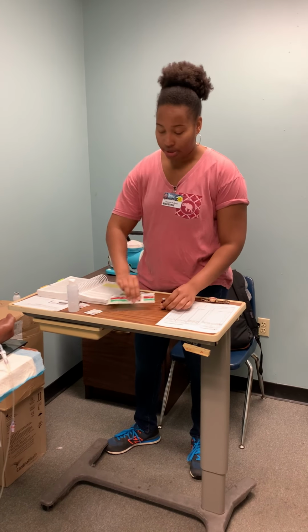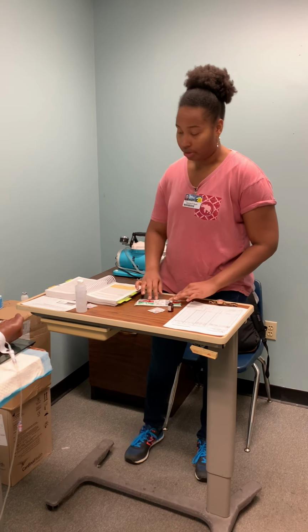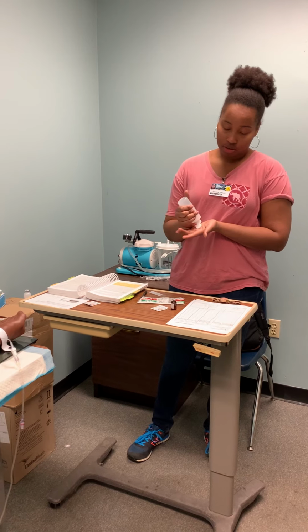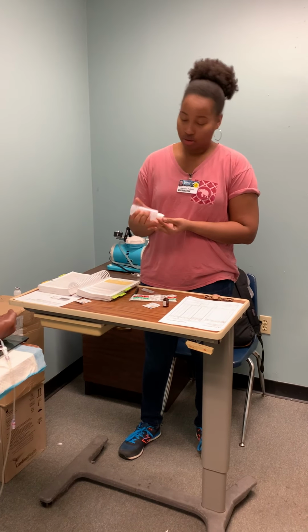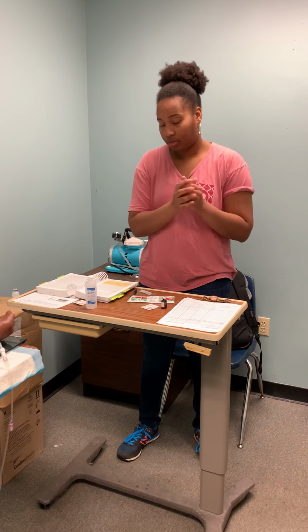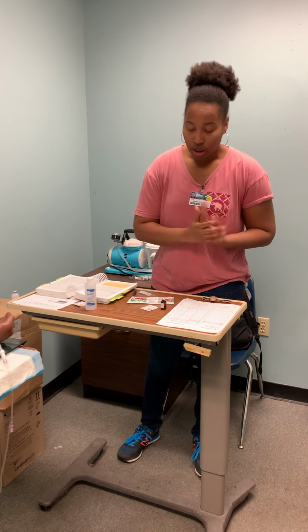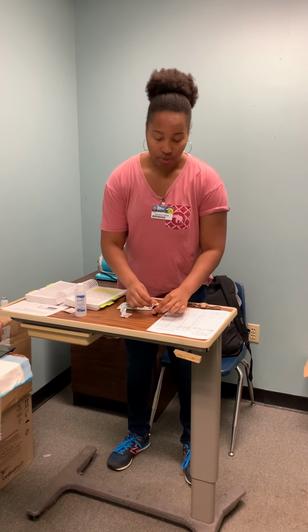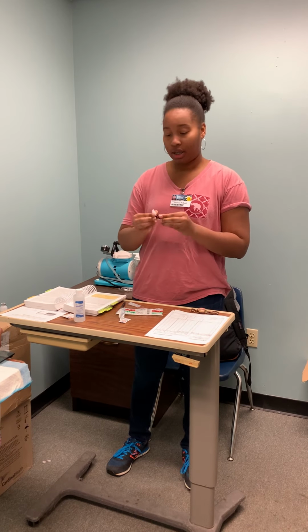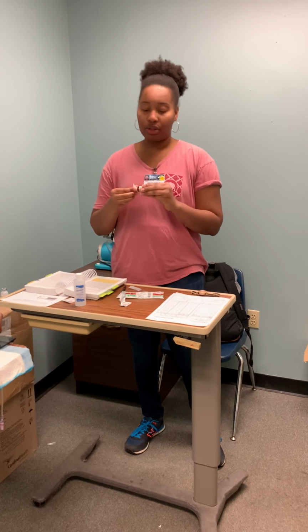Next, I'll gather my equipment for drawing up my medication. I'll wash my hands first. I will clean vigorously for 15 seconds. Also, the expiration date on this medication is July 2020.